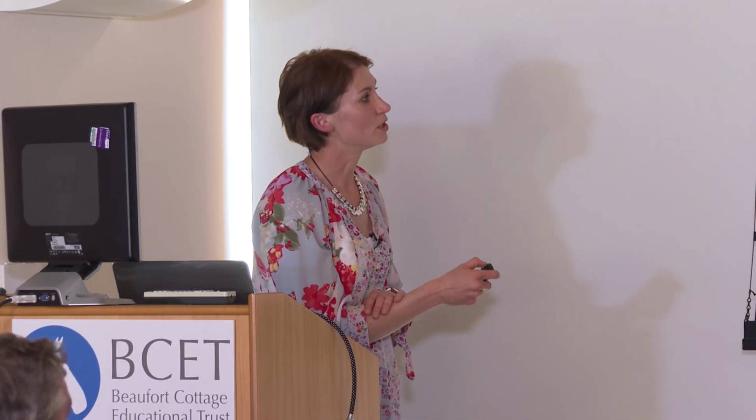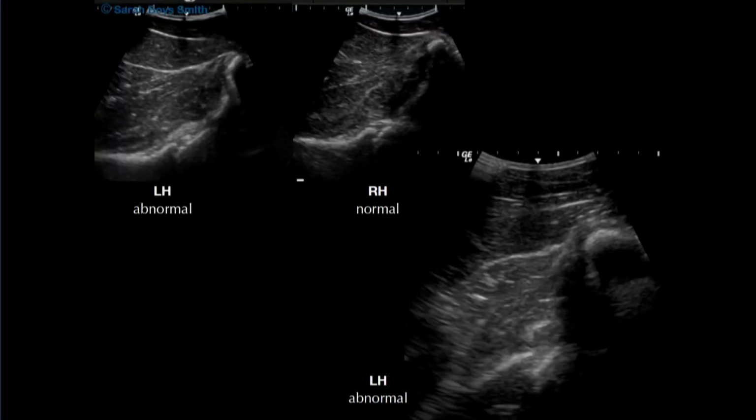This was a little foal that presented with an acute left hind limb lameness. We can see, so we've got left here and then right here. This has got significant hip effusion. So this is our joint capsule here. And then we've got our joint capsule here, so that we can see that that is bulging away from the normal architecture. And again, we can picture that down here as well.